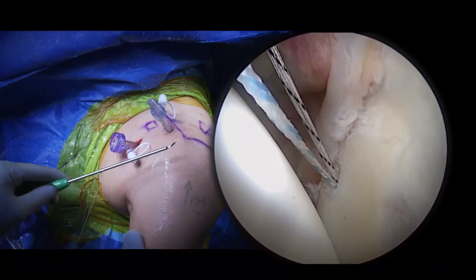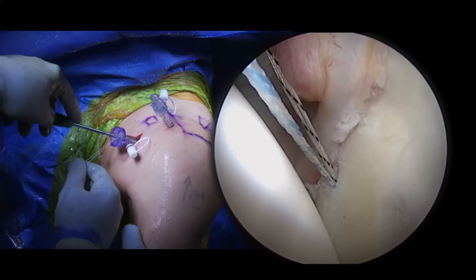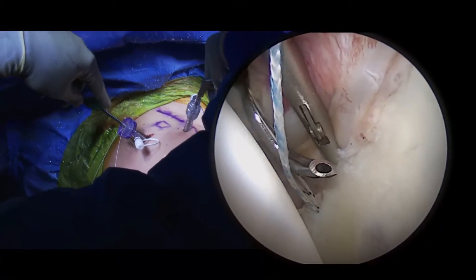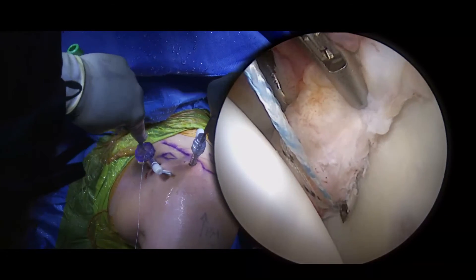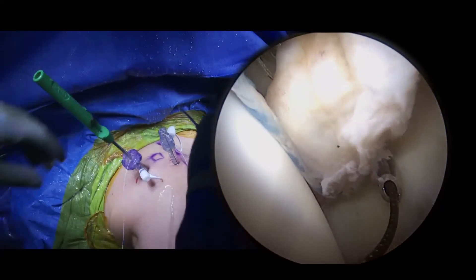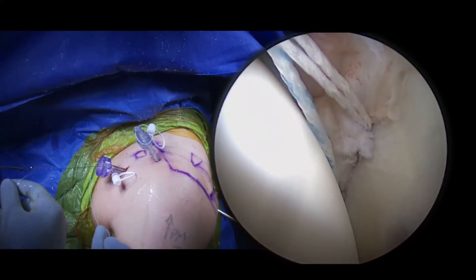A curved arthroscopic suture lasso is then placed through the anterior inferior portal, deep and inferior to the anchor, along with the aid of an arthroscopic grasper to place the soft tissue on tension and further facilitate a superior and medializing capsular shift. The looped nitinol wire is passed and shuttled through the anterior superior portal. The repair suture from the anchor is placed into the loop of the wire and shuttled through the soft tissue as it exits out the anterior inferior portal.